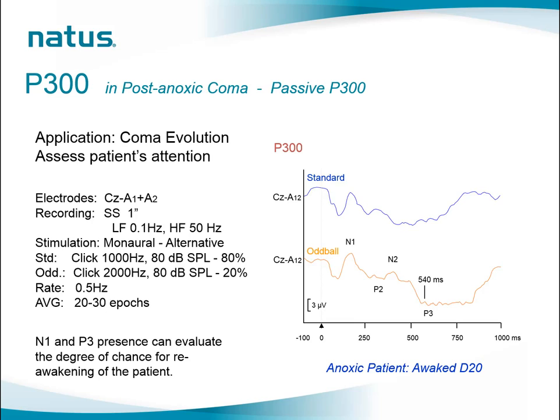This test has another alternative that is called MMN, mismatch negativity. If you are interested in that particular application, we have a clinical note on the website that actually provides you all information on the workflow for this specific technique.